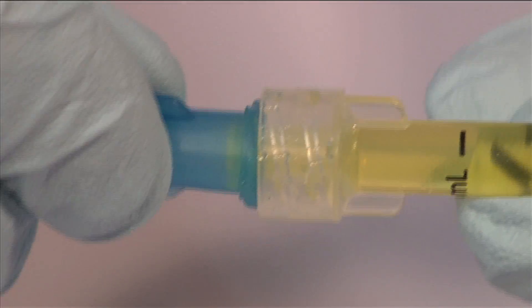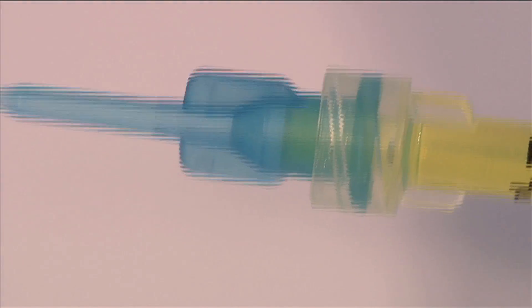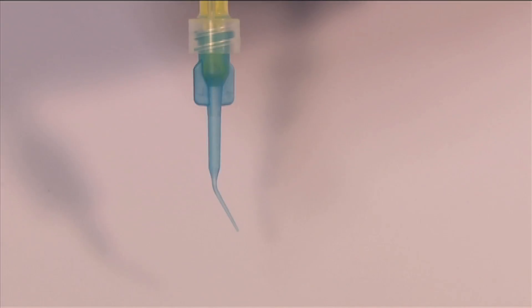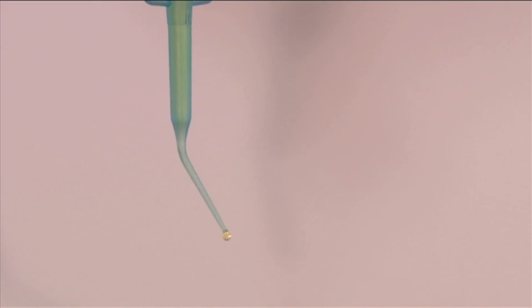Detach the syringe from the bottle and attach a microcapillary tip to the syringe at the luer lock. The microcapillary tip may be bent to improve access to the treatment area. Prior to subgingival placement, prime the tip by depressing the plunger slightly, filling the lumen with liquid until a drop is expelled at the tip.